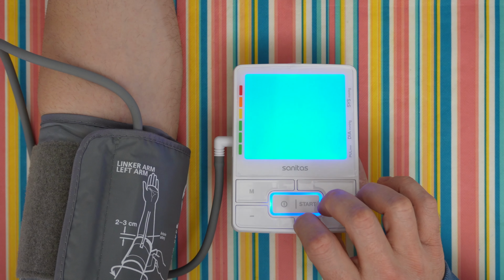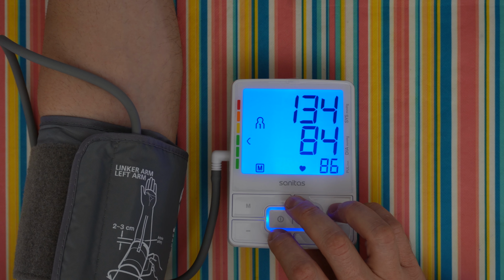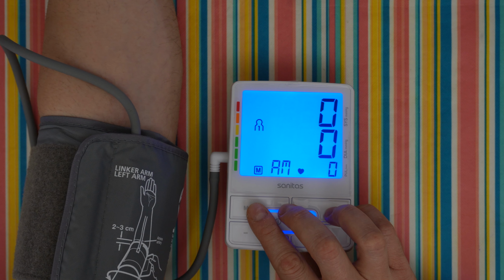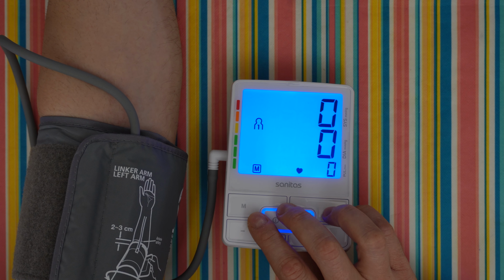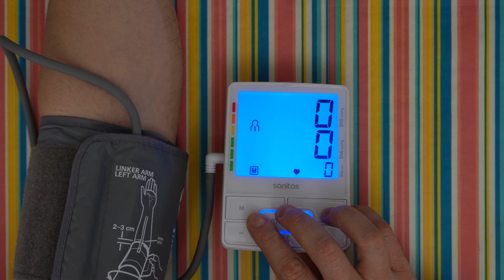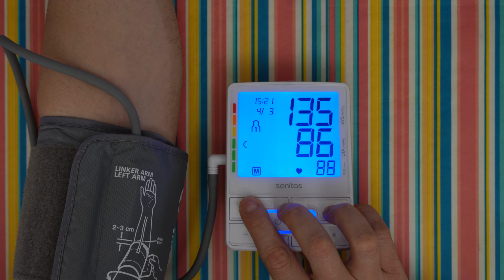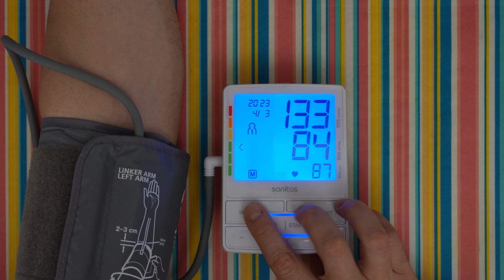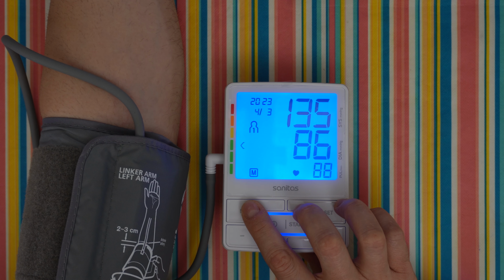Let's go again to the first user, M. We can see it's flashing the A on the display. It is the average value of all saved measurements. Press the M again, AM flashes on the display, the average value of the morning measurements. Press again goes to the PM, the average value of the evening measurements for the last 7 days. The same for the AM. We have the third measurement, second, first. And we can see the hour when this measurement was taken. And off again. Again we can see the hour for the third measurement, the second, and the first.